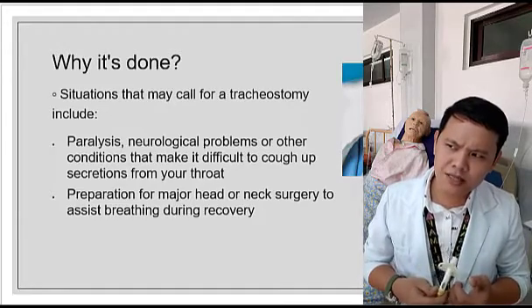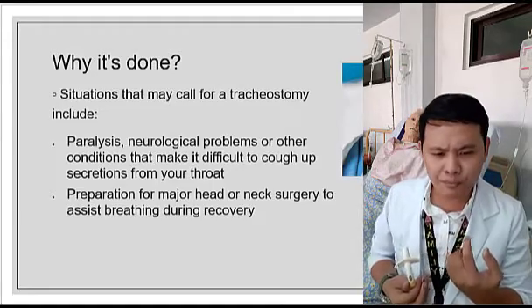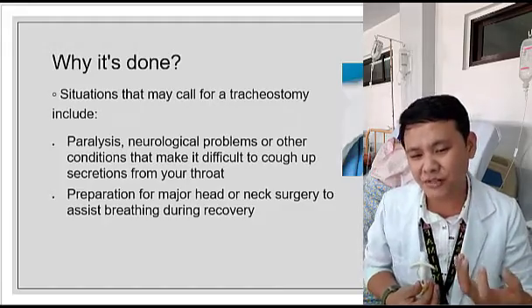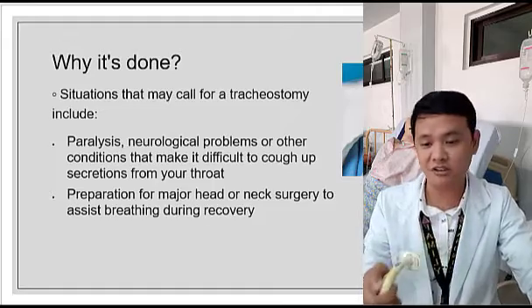What else? If there is a build-up of secretions in your trachea and it's really difficult to suction it through the oral route or the mouth, because we have a gag reflex that will be activated. So, this is what we will use. This is the best option for that, okay, the tracheostomy.